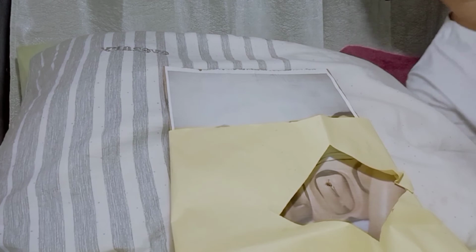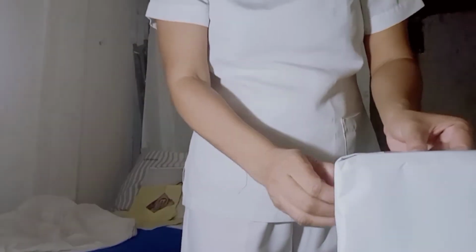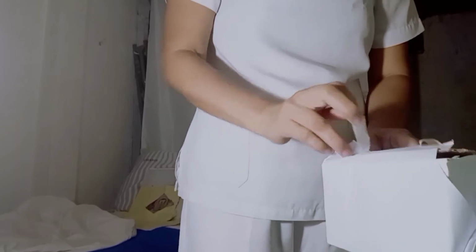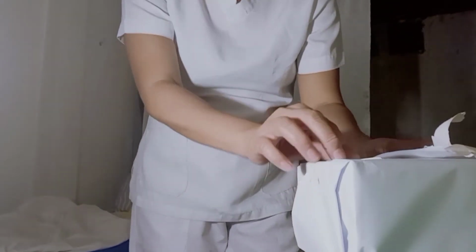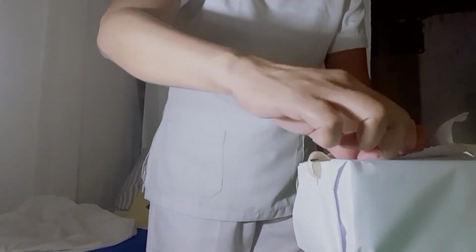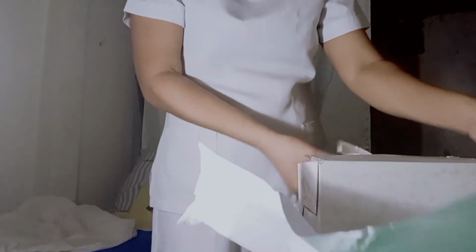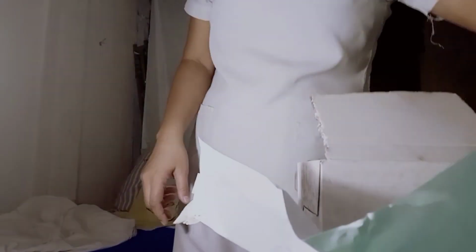Next procedure, set up the field carefully. Open the catheter set and remove it from the plastic outer package. Place the catheter set between the client's knees and carefully open the outer wrap. Remove the sterile drape without opening the inner fold. Next, here are all the equipment inside the package.